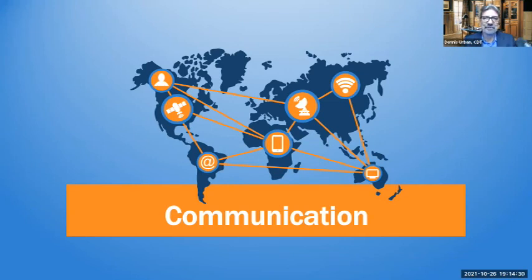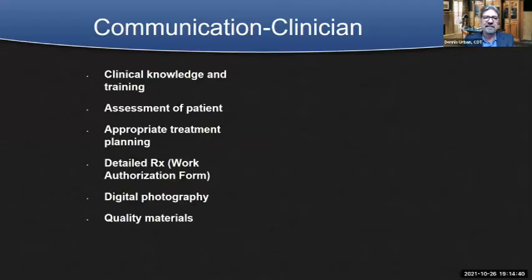So it's really important for us to collaborate on these cases and to bring forth a successful case that's going to be beneficial for the patient and also help enhance your practice. So communication with the clinician: we depend on your clinical knowledge and training, the assessment of the patient, the appropriate treatment planning, and detailed information on the work authorization form. We like that detailed information with digital photography, and we want the use of quality materials for a good outcome of the case.